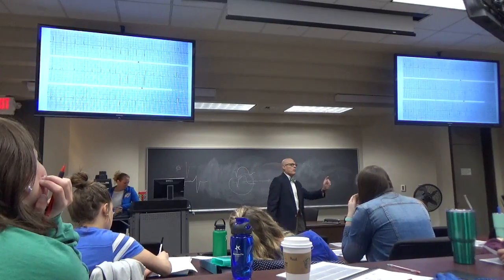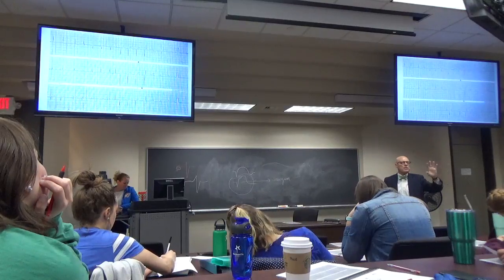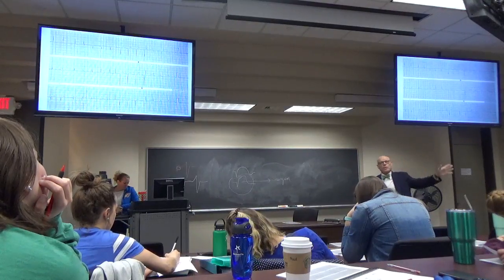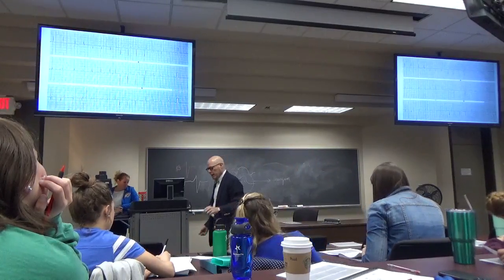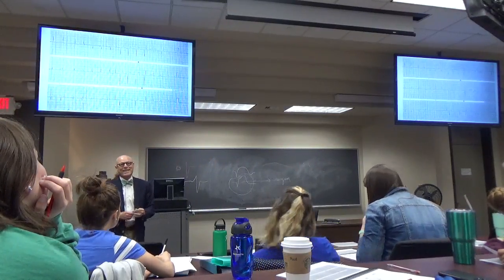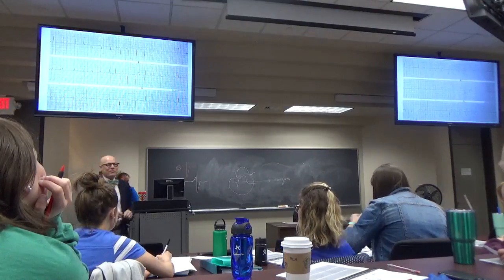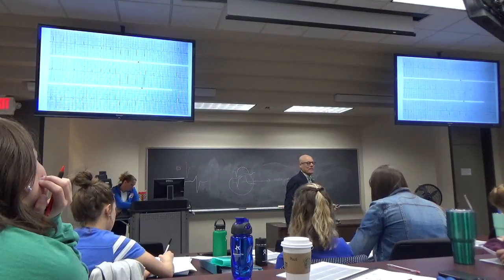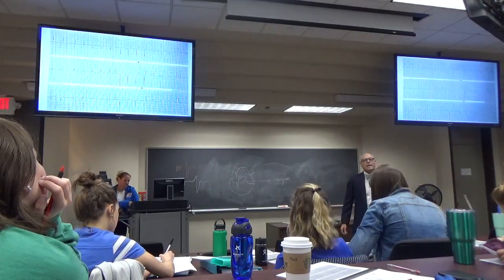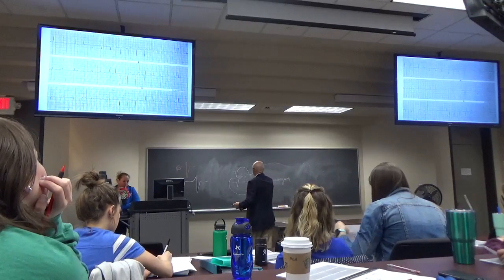Okay? Now, trying to figure out what your EKG shows, it helps so much to have an old EKG. You'll hear clinicians say, you know what I need is an old EKG. There isn't any. Here, you got this guy, he's from Baltimore, he's in your ER, and you don't have an old EKG. But you would really like to have one. You see, when did he have these Q waves, a year ago?